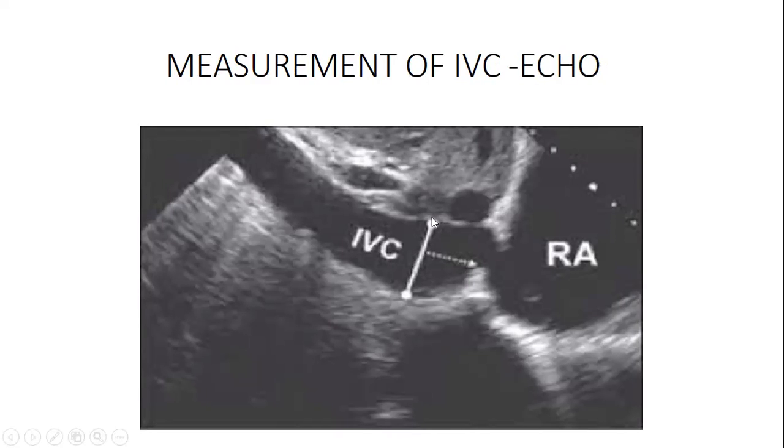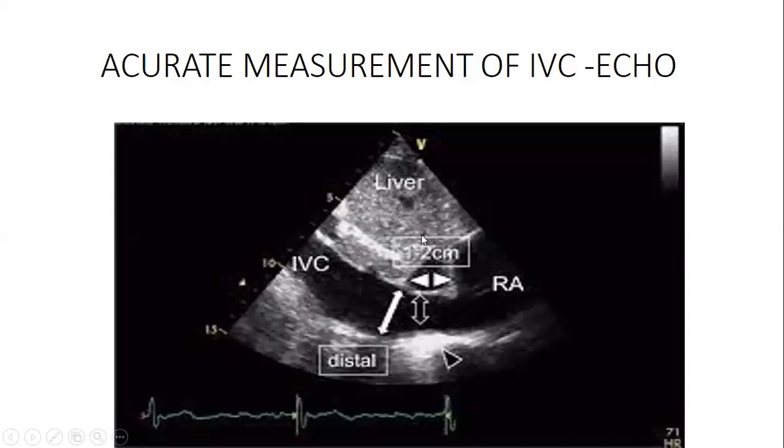The collapsibility index can also be observed just by eyeballing and looking at how it's collapsing. So this is very key to note. Sometimes within a short 2, 3, 4 seconds, you get your quantification. Again, this is where you get your collapsibility index and check what is happening there.